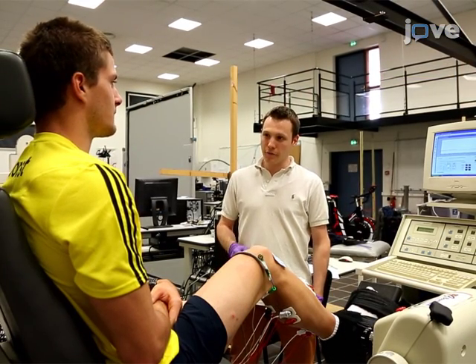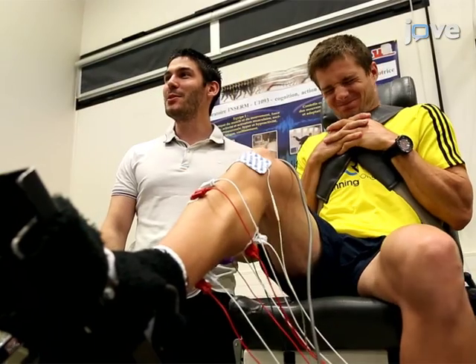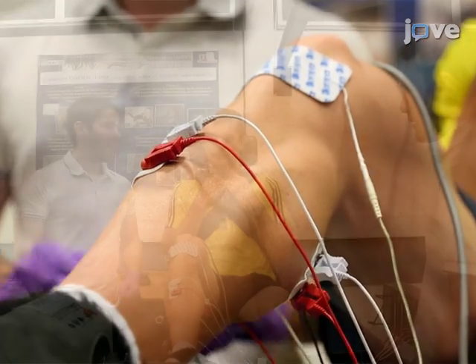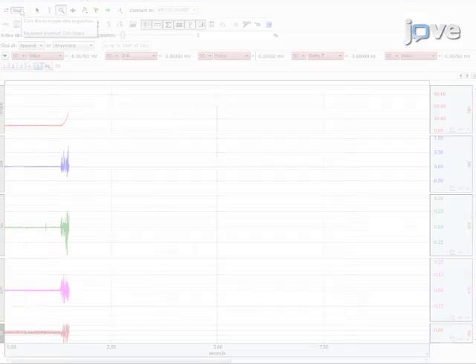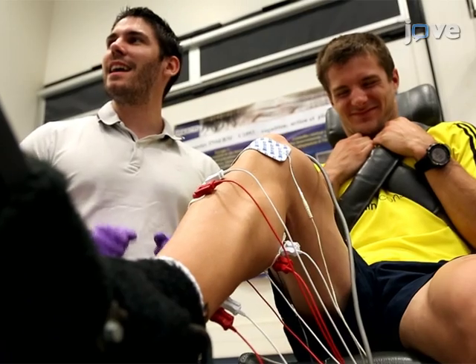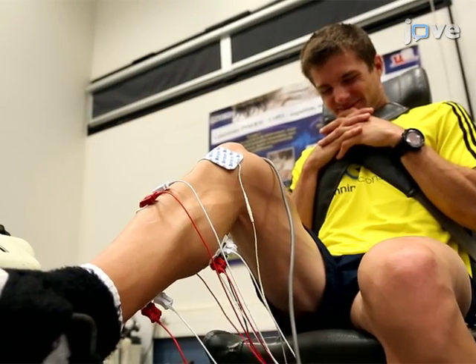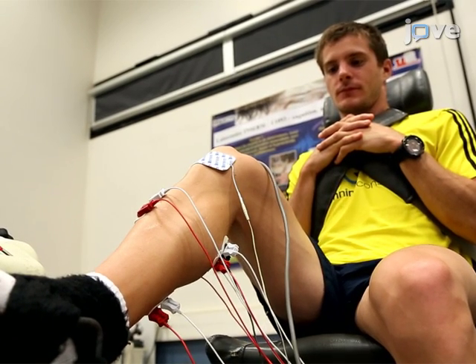Instruct the participant to perform an isometric maximal voluntary contraction of the plantar flexors. The participant must push as hard as possible against the ergometer by contracting the plantar flexor muscles. Give visual feedback during the effort with standardized verbal encouragement. The maximal voluntary contraction is reached when a plateau is observed. At the plateau, deliver a paired stimulation at 100 Hz frequency at supermaximal intensity. Immediately after the contraction, deliver another paired stimulation when the muscle is fully relaxed to evaluate the voluntary activation level.